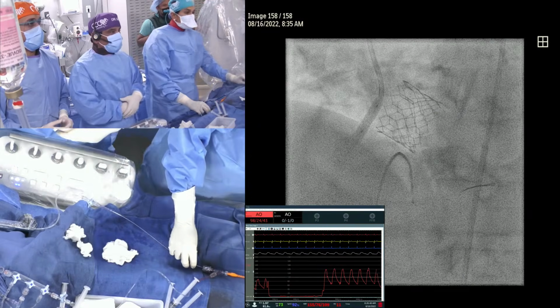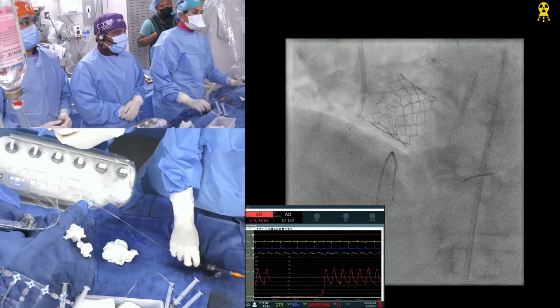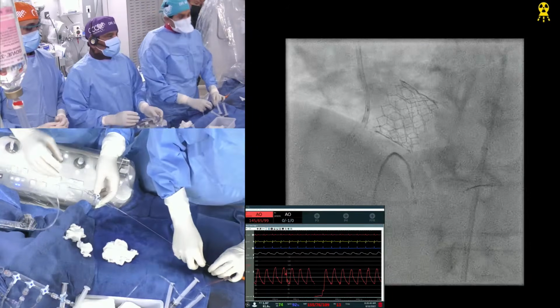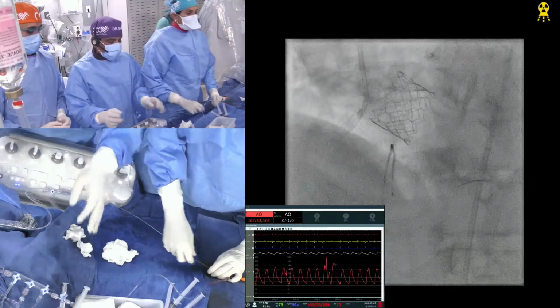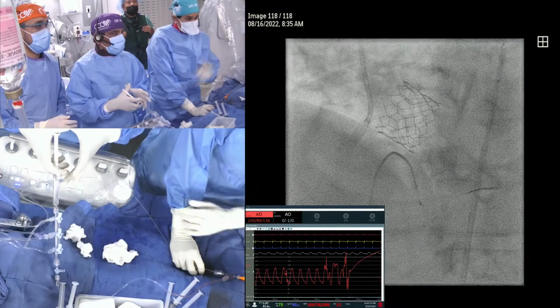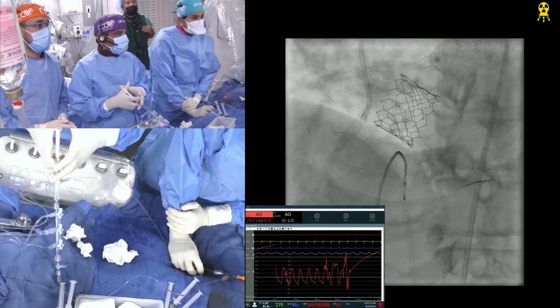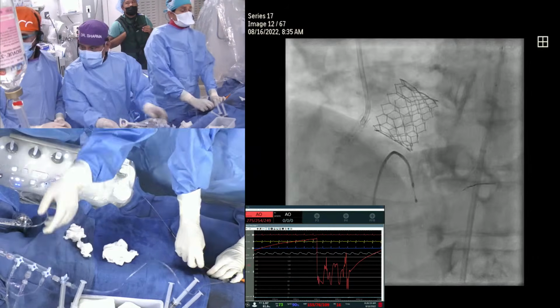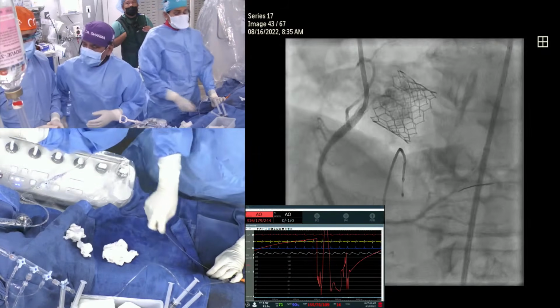We used to use it in the ostial lesions in the past. You have to have a few millimeters more. No, this is sticking out. Sticking nicely. Yeah, but there are two layers now. No, this is one layer. Now two layers, yeah. Angiographically it is absolutely pristine.